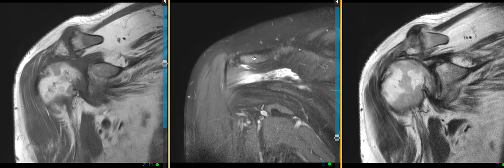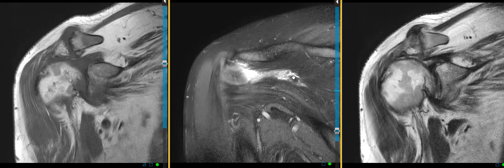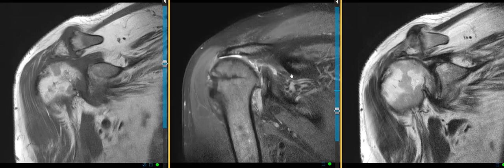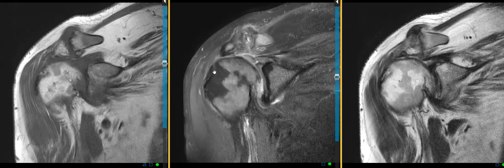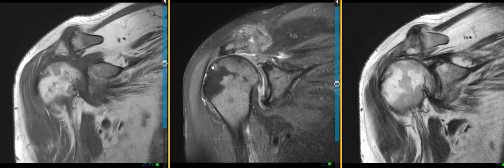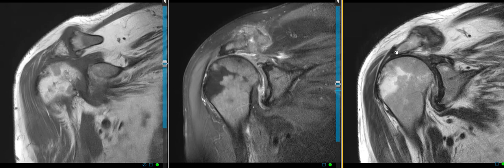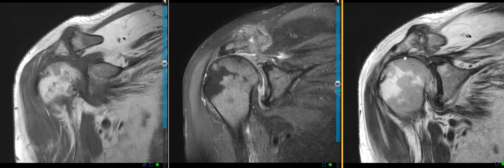When we go backwards we get into the infraspinatus tendon here and we don't see a normal tendon. We see this white, which means there's fluid — a fluid-filled gap. The end of the infraspinatus tendon is torn from way over here and retracted way back, so the entire infraspinatus and the entire supraspinatus tendons are torn in a massive rotator cuff tear. The humeral head has drifted upwards and contacts the acromion process here — a bone-on-bone configuration — because the rotator cuff that's supposed to separate those and attach over here is gone.